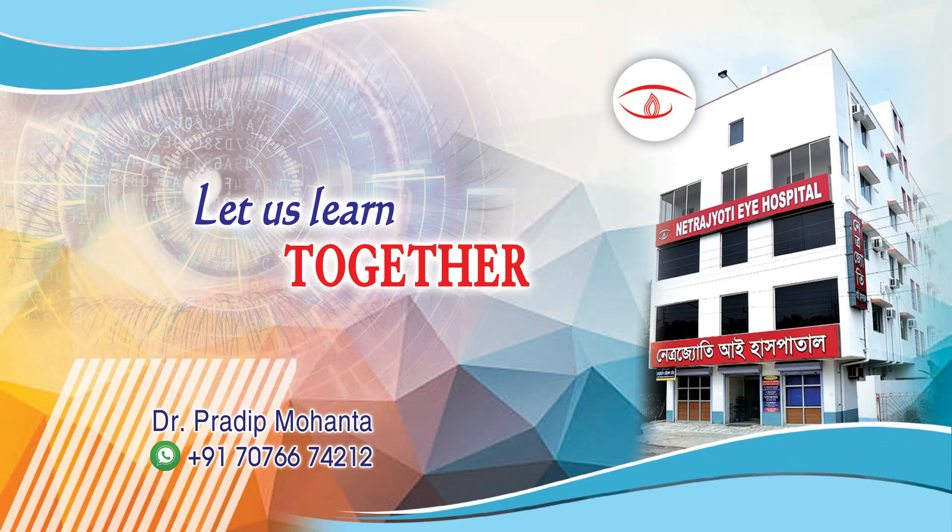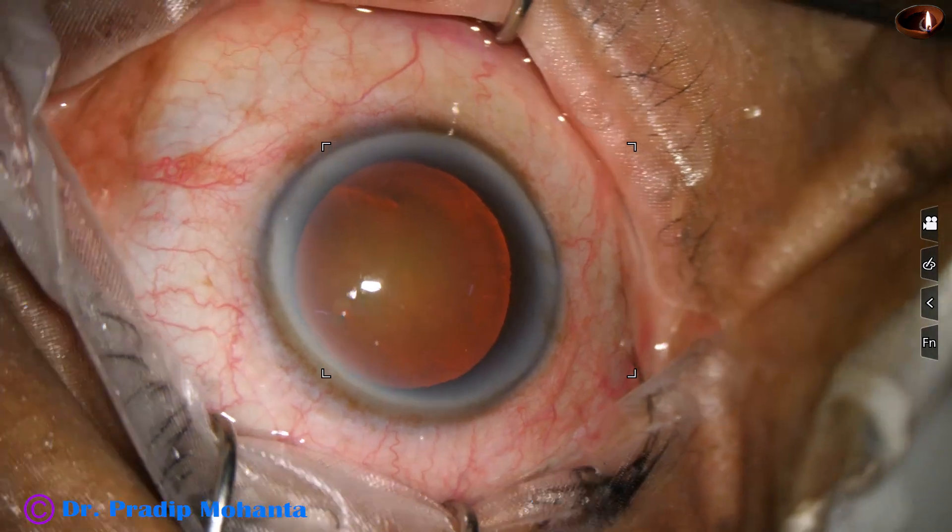In this video we are going to see totally unedited management of a cataract with grade 3 plus nuclear sclerosis.